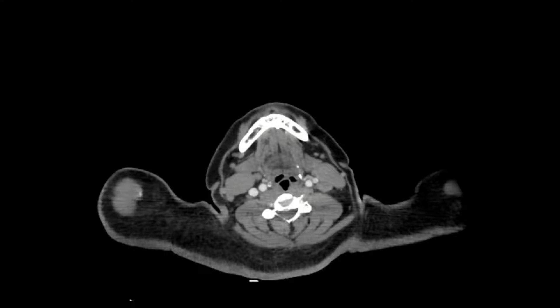Now we're going to talk about the submandibular space — and again the carotid space, and the paravertebral space. At the same time, we have other spaces coming up: for example, this is the posterior cervical space — this whole bit of it.